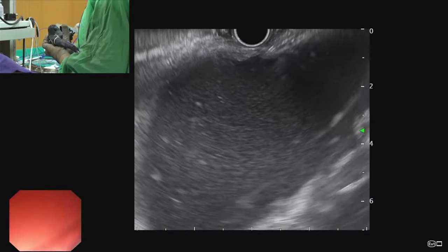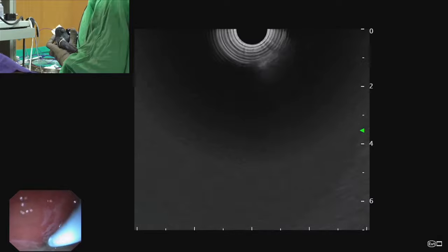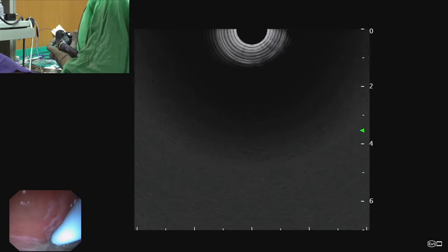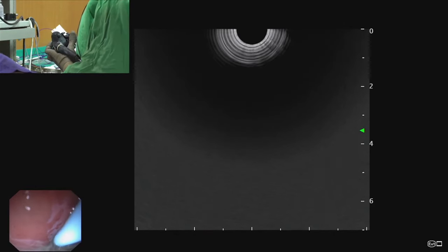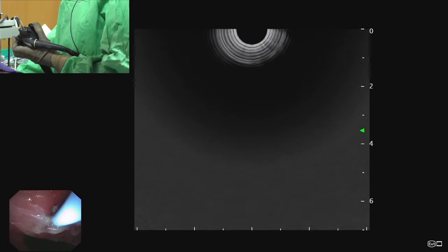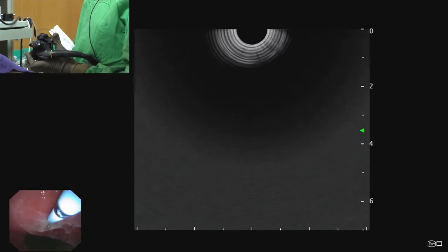We confirm the wire is visible and the catheter is going into the collection. Once the catheter has gone inside, we can switch to endoscopic vision since the catheter is a thicker accessory and the risk of wire displacement is lower. Under endoscopic vision, we push the stent inside the walled-off necrosis — pushing half the stent inside. A black marker indicates the proximal end of the stent. We then remove the central catheter and form a loop inside the cyst, using the down-dial to apply force away from the puncture site, creating a loop formation in the gastric lumen.